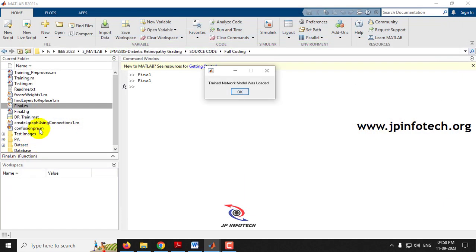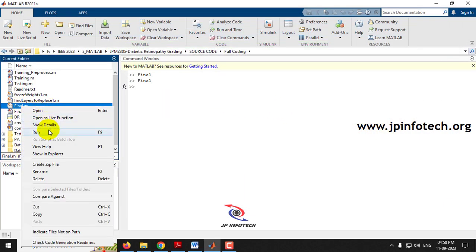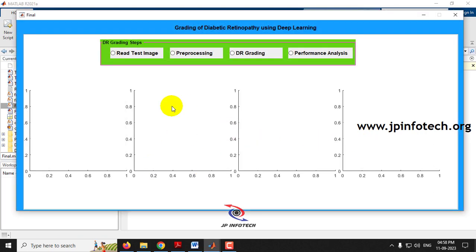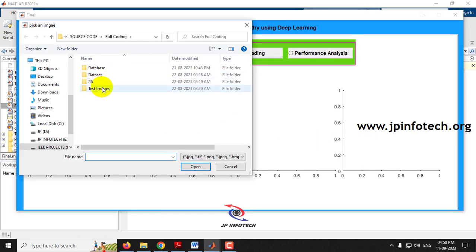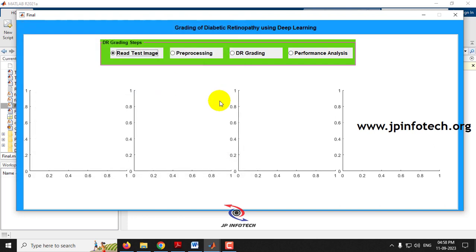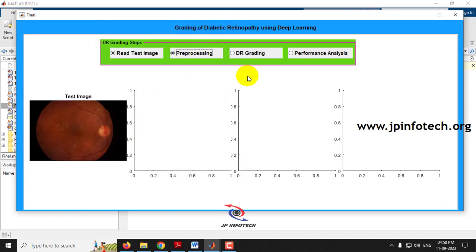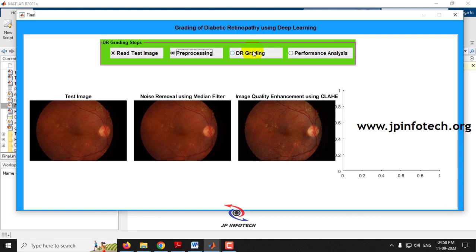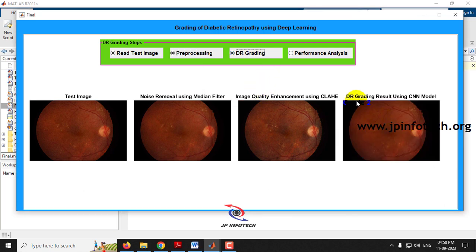For the next case, reading a test image from Grade 2, selecting the image, then applying pre-processing — the pre-processed image is displayed. Running the diabetic retinopathy grading step classifies the image as Grade 2.